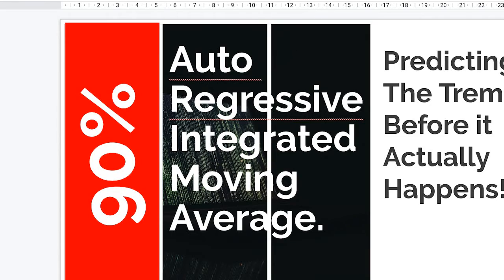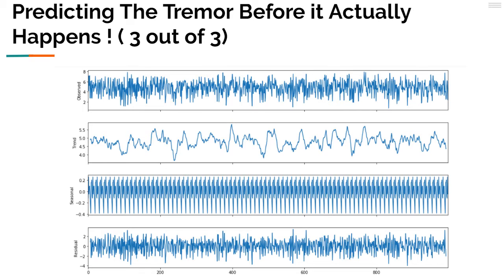We are going to explain the seasonal auto-regressive integrated moving average model that we have used in the deep learning part of our system. I'm going to explain how exactly we have worked on it. The first one is the collected data, which is nothing but the observed data. Now, we separate the trend out of the observed data, and that's the second chart that you are seeing in front of you. Then we understand the seasonal data, the spikes of seasonal data for the observed data, and that's also present in front of you. Now, the residual data has to be calculated because the trend and the seasonal data together have to be subtracted from the observed data for you to understand the residual data, for you to make the learning and the process very smooth.